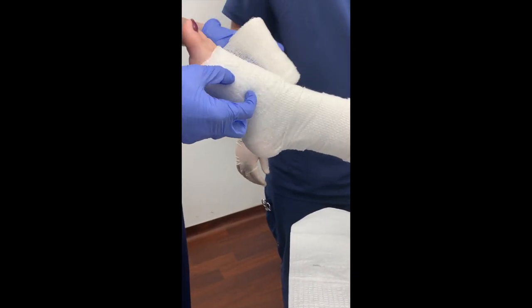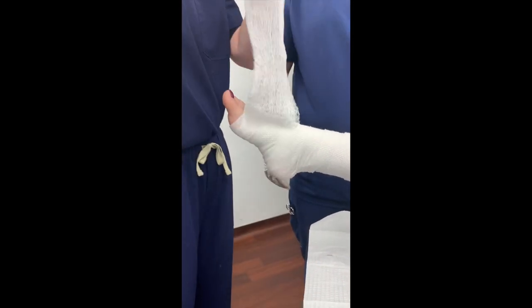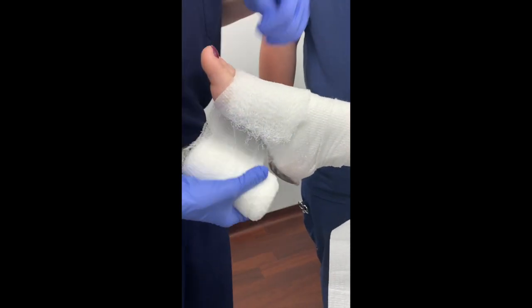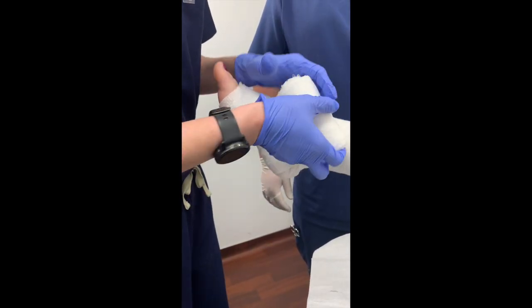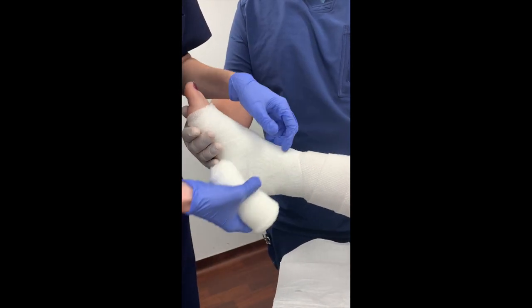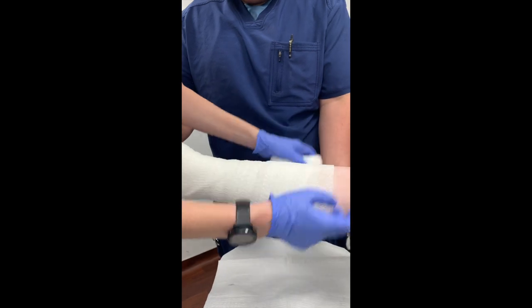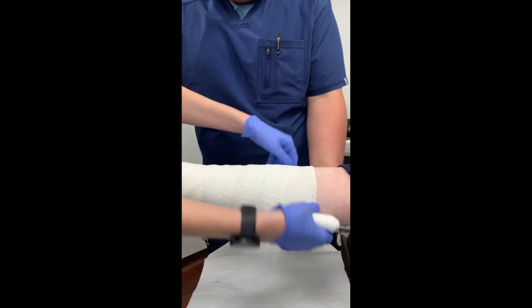I was going down into the arch — something I catch myself on even — but you can always restart. Just make sure your patients are comfortable; it wouldn't be detrimental to do it that way, but might as well do it right. Come down, capture that heel, and then come up 50%, 50%, 50%, 50%, right up to the tibial tuberosity, which is your bony landmark up here.